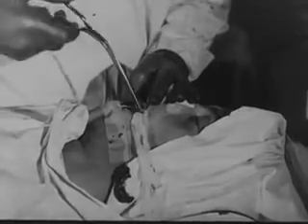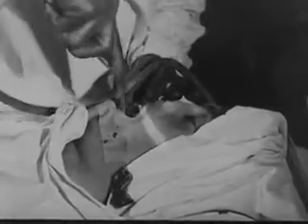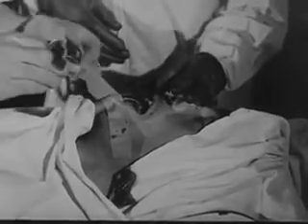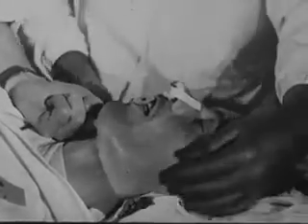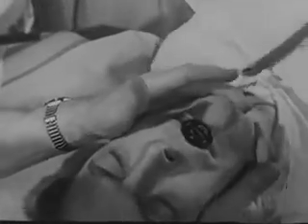Here we see the end of a nasal operation. During the course of the operation, the pharyngeal pack has prevented blood from running down towards the glottis. When the pack is removed, suction is used to clear away any blood which may have trickled down from the nasopharynx. After this, the airway is first inserted and the endotracheal tube is then removed. It is a good practice, where possible, to retain the tube in the trachea until the cough reflex is active. Coughing is a safeguard which prevents blood and other foreign fluids from being inhaled.